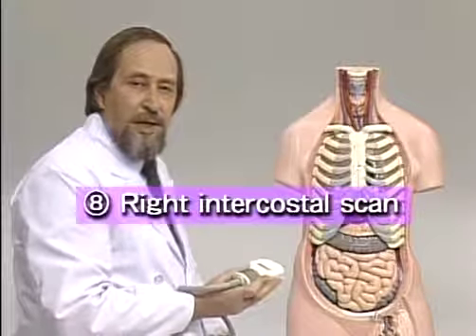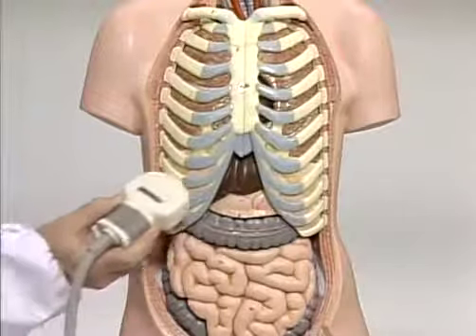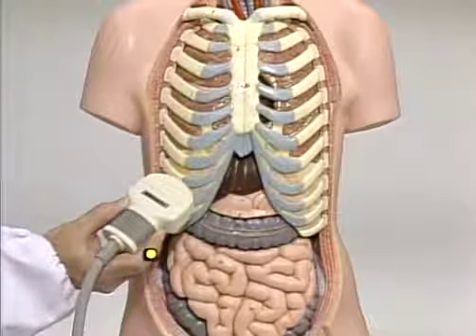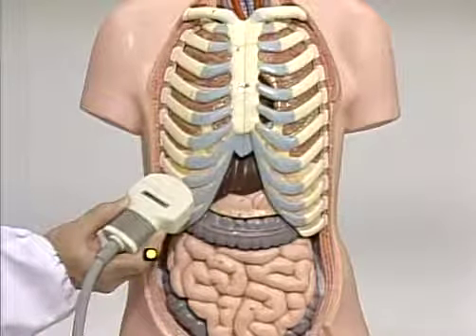Now, the last is the right intercostal scan. This procedure is used mainly to observe the right hepatic lobe, gallbladder, and right hepatic duct.